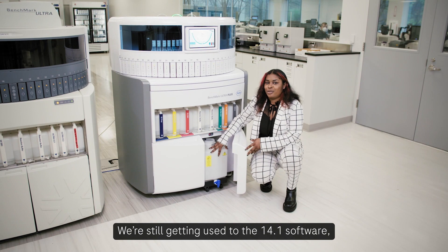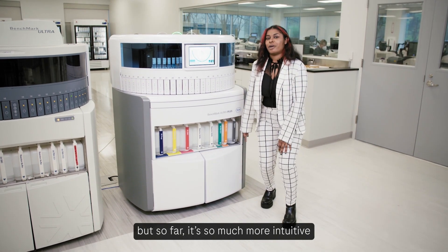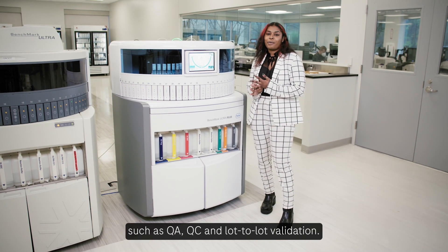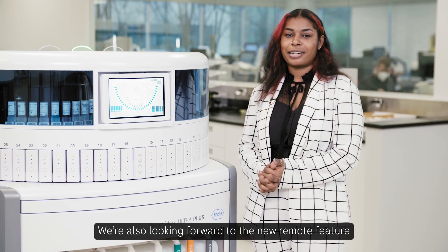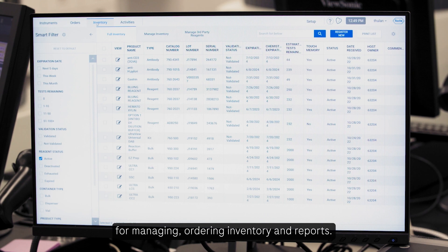We are still getting used to the 14.1 software, but so far it's much more intuitive and gives us new capabilities such as QA, QC, and lot-to-lot validation. We're also looking forward to the new remote feature for managing, ordering inventory, and reports.